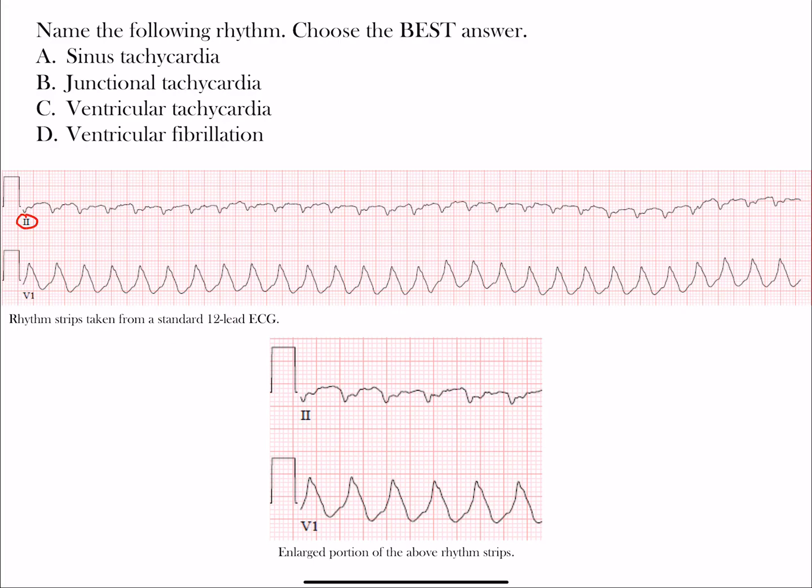Notice we have lead two, one of our inferior limb leads, and lead V1. These are rhythm strips taken from a standard 12-lead ECG, and then here's the enlarged portions of it, just to help you see those little small squares there if you need any assistance with finding the rate.